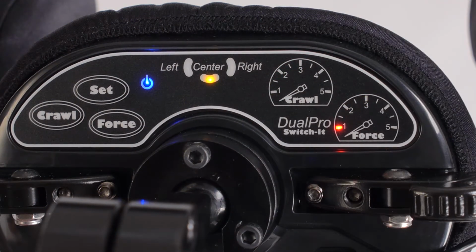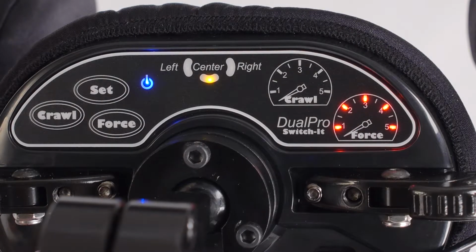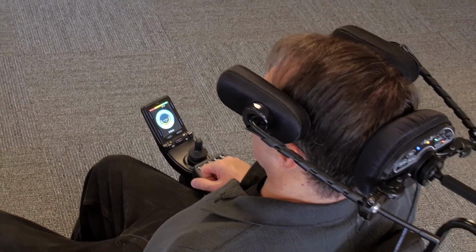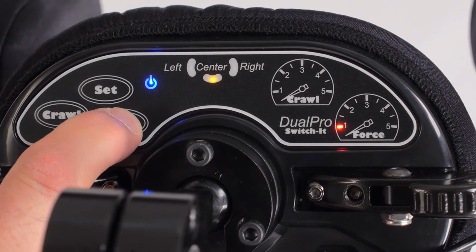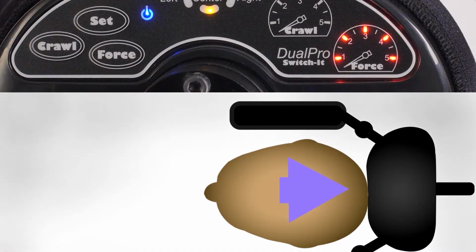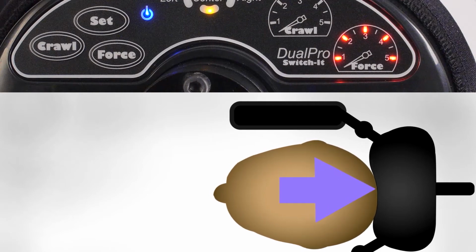If only one light is lit, it takes very little force to reach full speed. If all 5 are lit, it takes a significant amount of force to reach full speed. Utilizing all 5 lights also helps ensure a more gradual acceleration. Like crawl, force is set by pushing the force button in the programming mode. Each push adds a light until all 5 are lit. The next push cycles the settings back to 0. The more red lights that are lit, the more force required to reach 100% of the chair's speed.